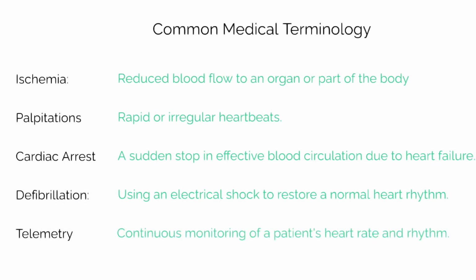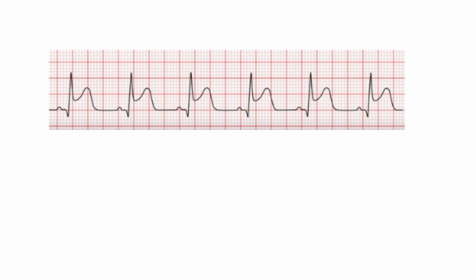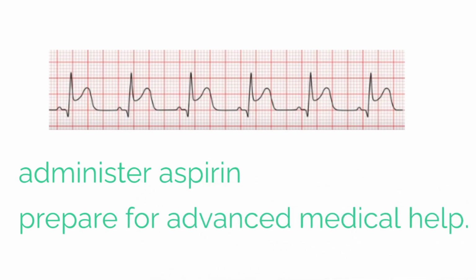Let's take a quick look at a real-world scenario that you could encounter. Imagine you're on scene with a patient complaining of chest pain. After performing a quick assessment, you obtain an ECG. The ECG shows ST segment elevation, and this can indicate myocardial infarction or heart attack. Recognizing this pattern allows you to take immediate action, such as administering aspirin and preparing for advanced medical help.